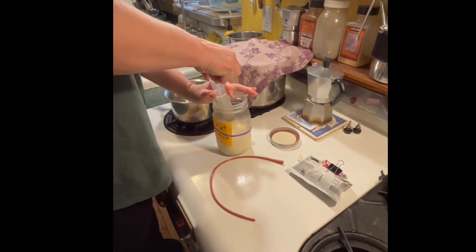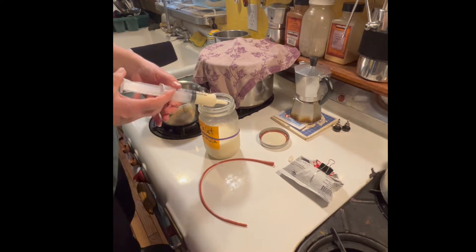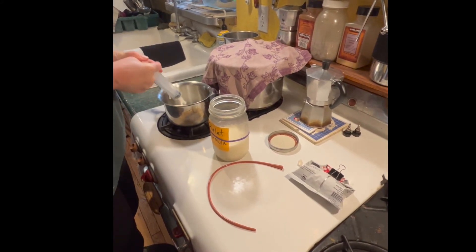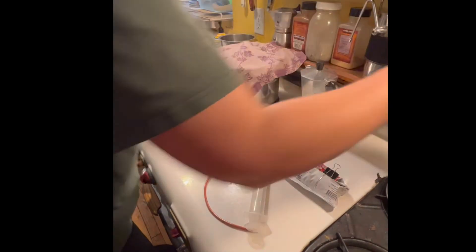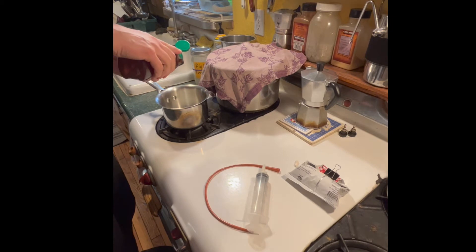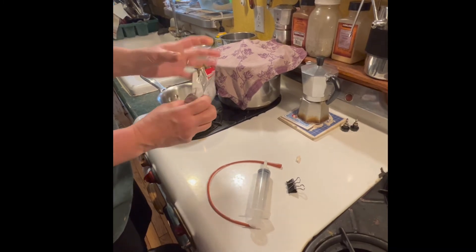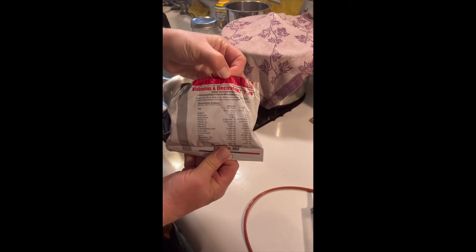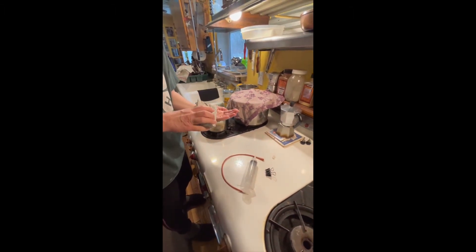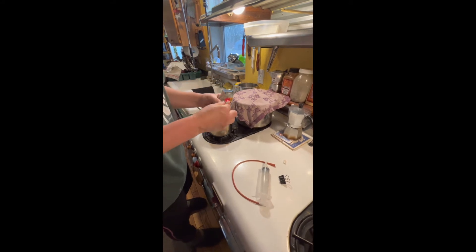I'll draw that up like that and squirt it into my little spot here. To this I add two drops of raw honey — just to keep this piggy's sugars up because it seems to be having sugar issues. Then this is a vitamin, mineral, and electrolytes powder you can get at a feed store. I just take the tiniest little bit — that's actually quite too much — and I add that to it.